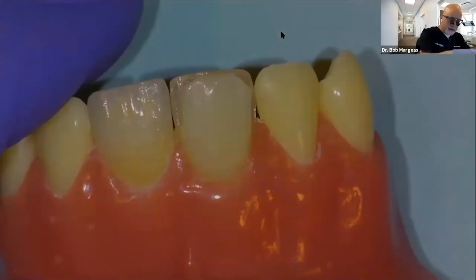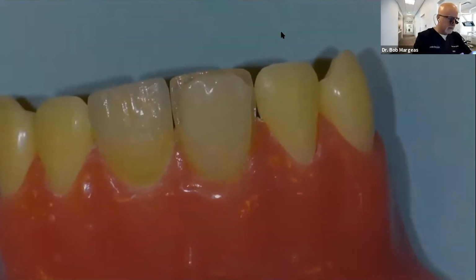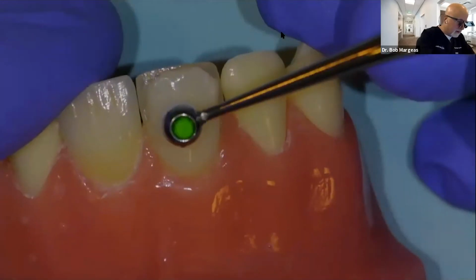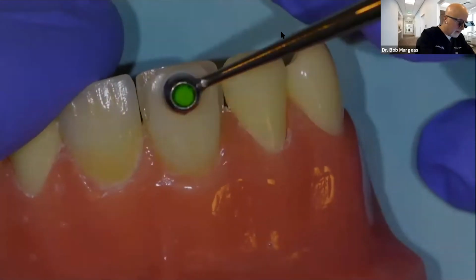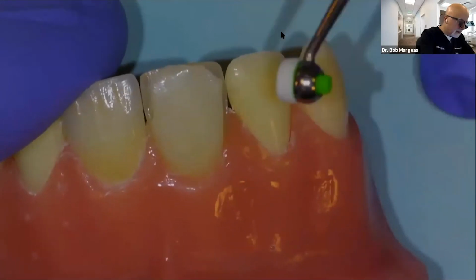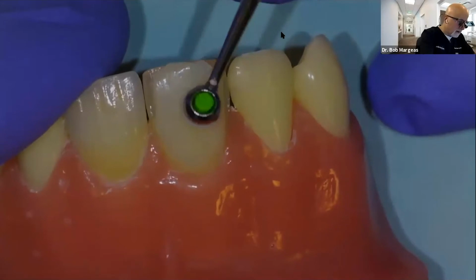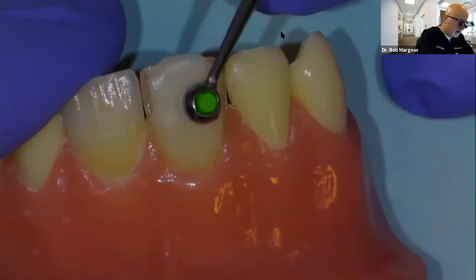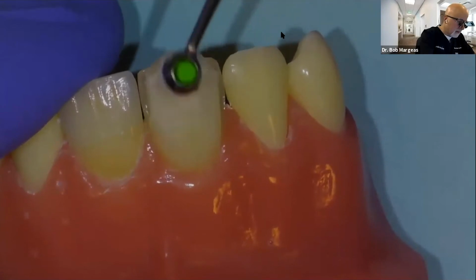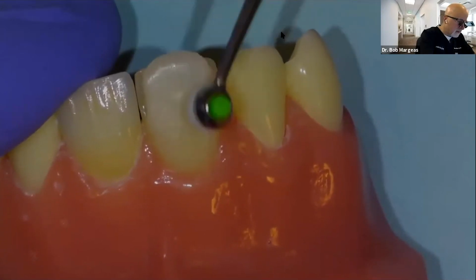So here's the Optrosculpt. It's a very nice instrument that you can pad the material, and you'll notice how it won't stick. It won't stick to this instrument. Very, very interesting instrument because it can smooth out and move the material.